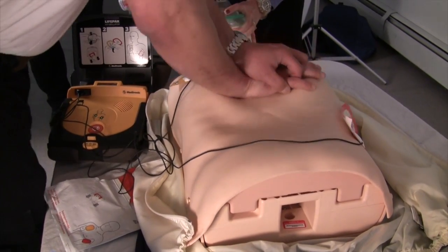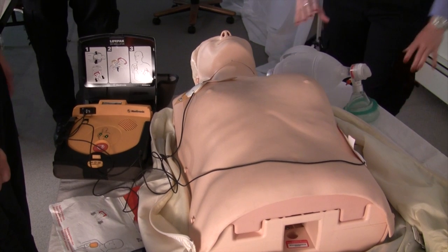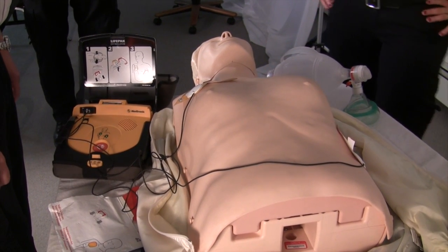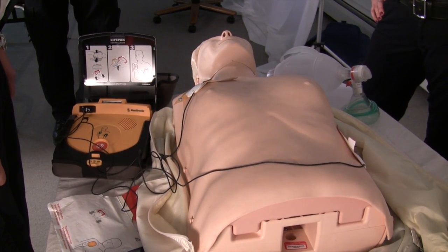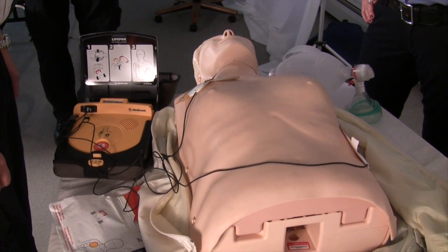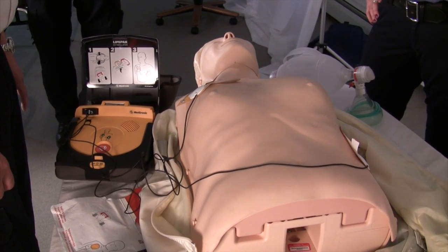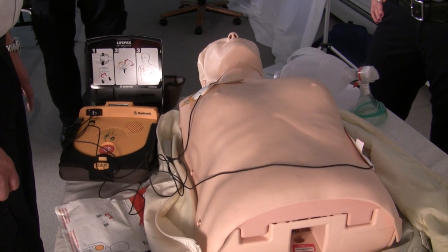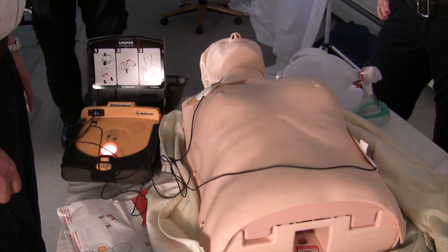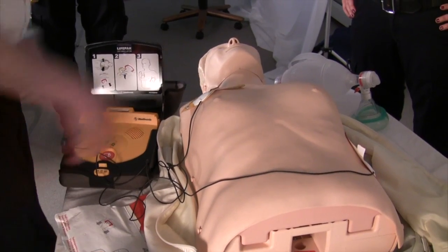Do not touch patient. Evaluating heart rhythm. Stand by. Preparing to shock. Everyone clear. Press flashing button. Shock delivered.